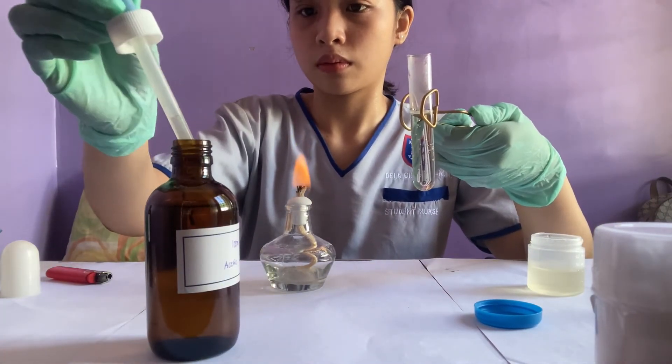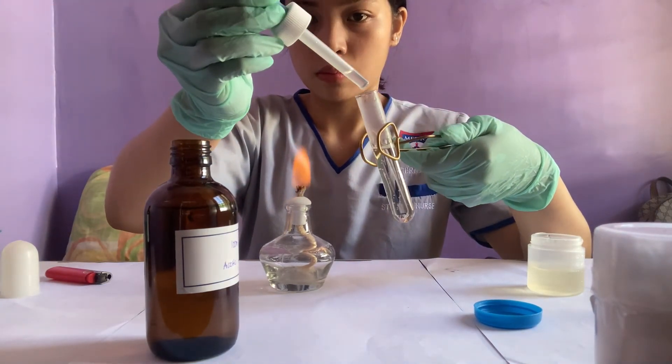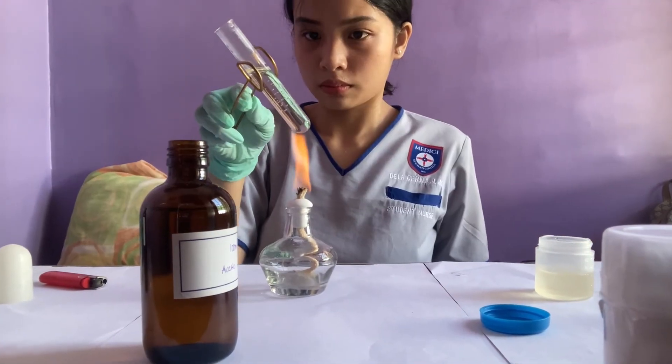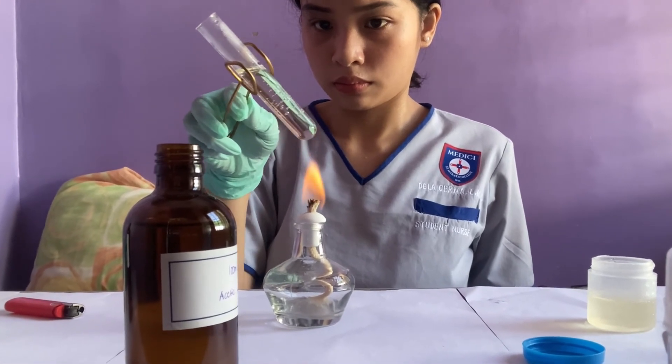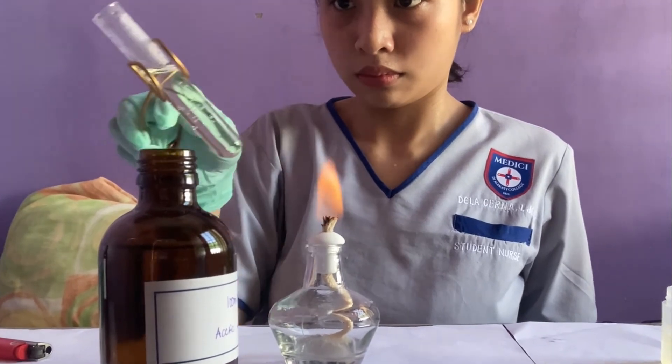I added 3 to 4 drops of acetic acid and boiled it again. As you can see, it does not become turbid or cloudy — it remains clear all throughout.